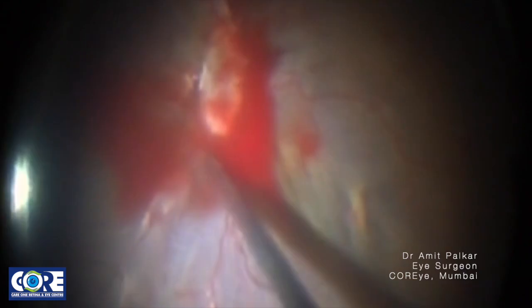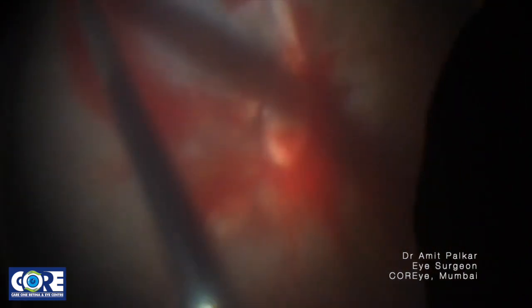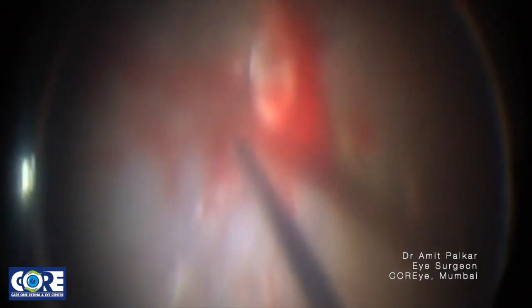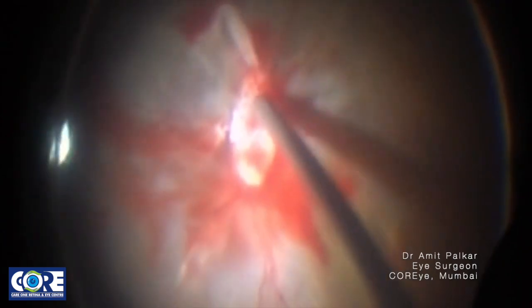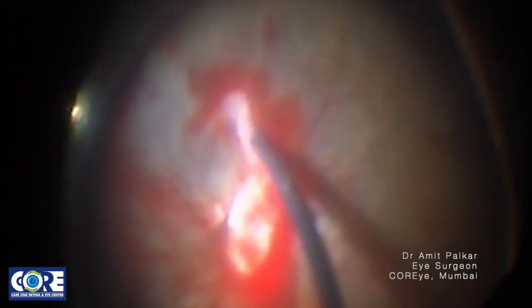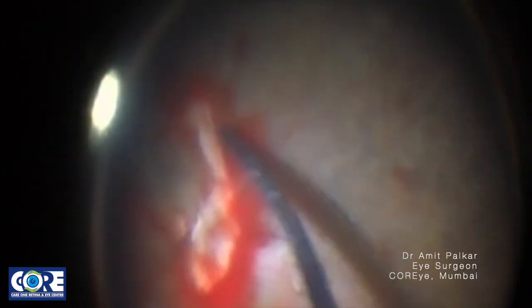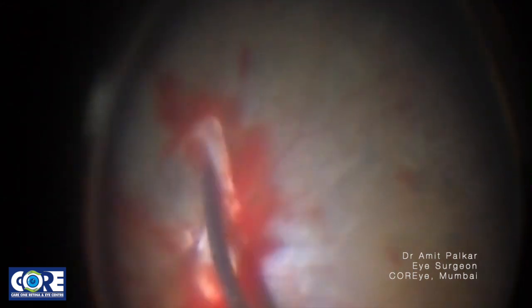In the meanwhile, there is oozing from the severed small twigs. Clearing the heme is very important because it hampers the view of your membrane dissection and is the most common reason for iatrogenic breaks. Again with the blunt spatula, trying to find a membrane. Appears to be quite adherent.